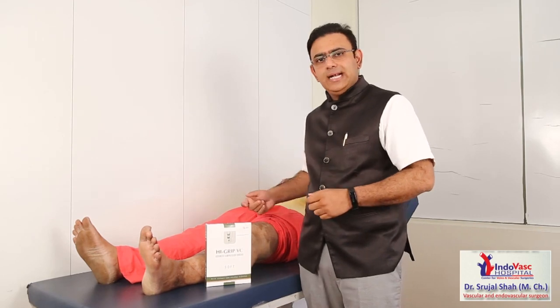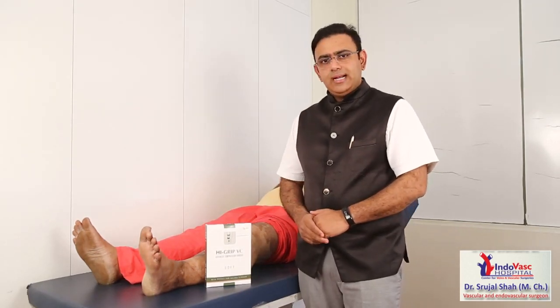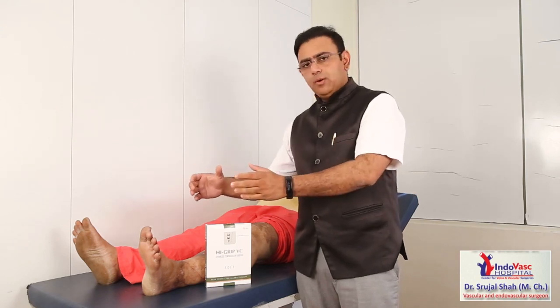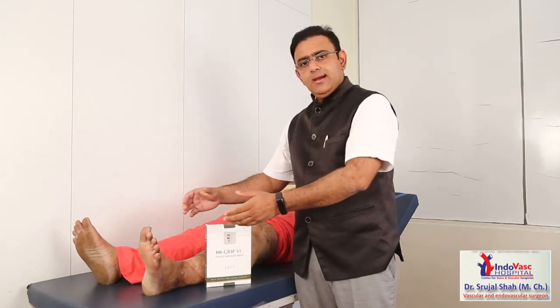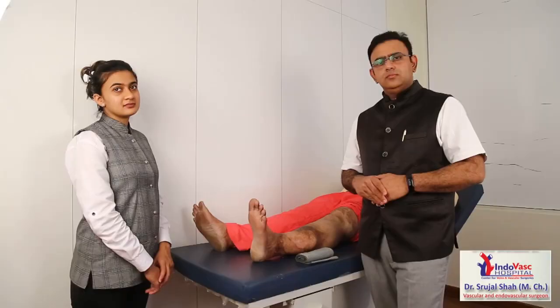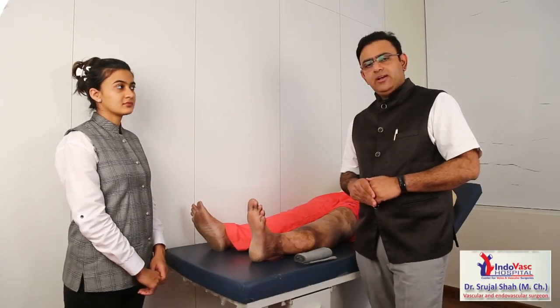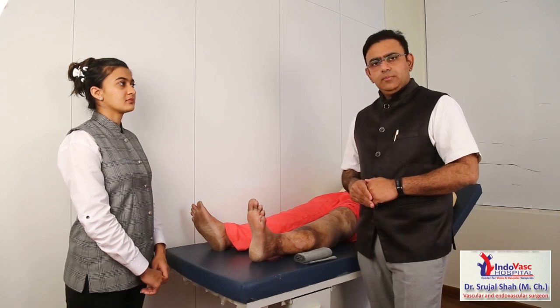Usually what happens when we ask the patient to use a bandage is that it slips out from the lower edge and the clips get lost. This company has come out with an innovation — they have made a pocket in the lower part which fits into the foot, and they have also added a velcro for high grip. This is very patient-friendly, and I am going to demonstrate how to apply it.